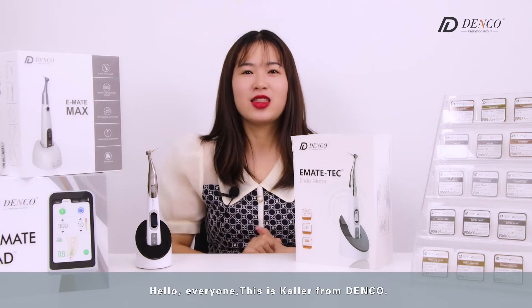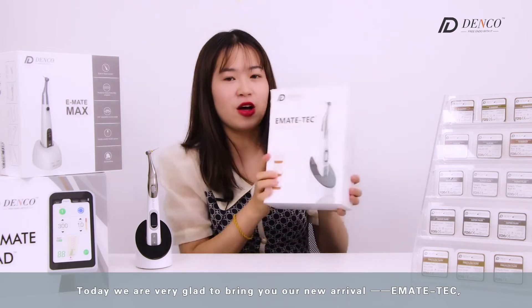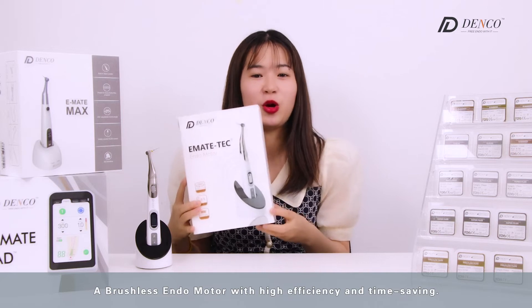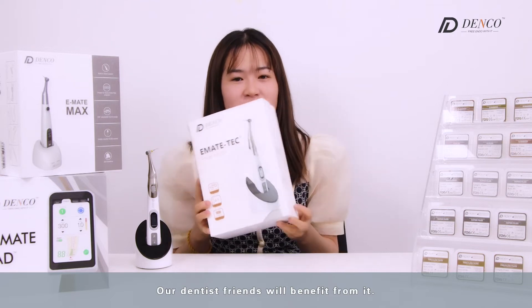Hello everyone, this is Connor from Denco. Today we are very glad to bring you our new arrival, the Emate-Tec — a brushless endo motor with high efficiency and time saving. Our dentist friends will benefit from it.